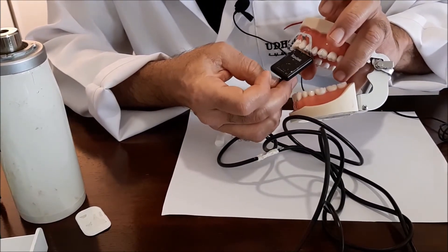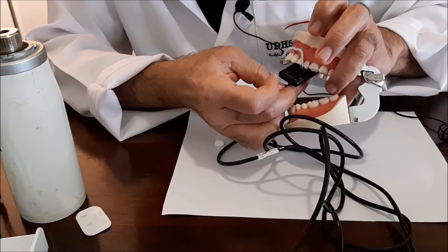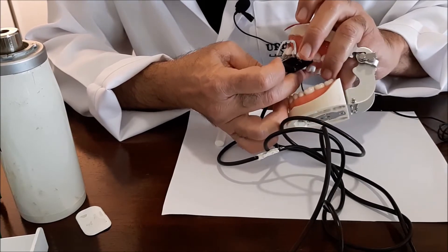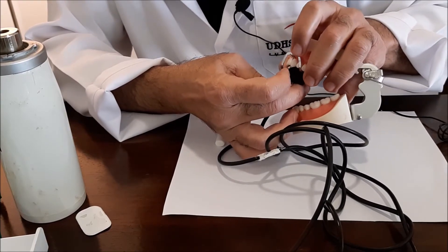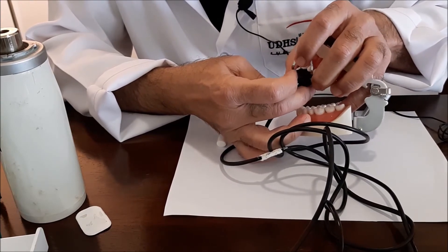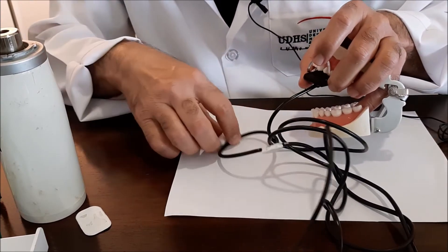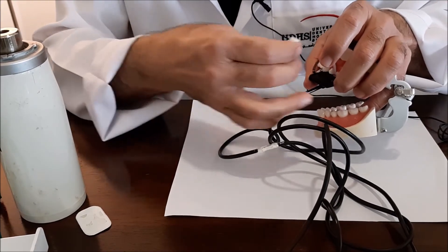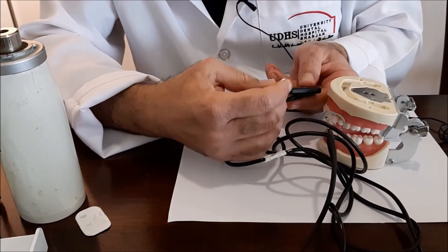So let us go back again. See, you go back, back, back, and then you rotate. See what happens? Now you will give a chance for the sensor or you will utilize the widest or the longest dimension of the sensor so that it will capture the canine. Let me do it again.